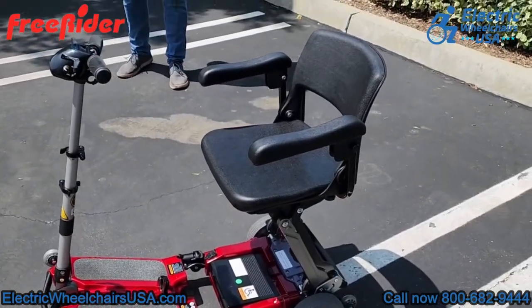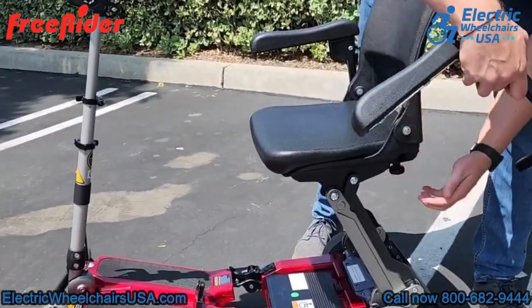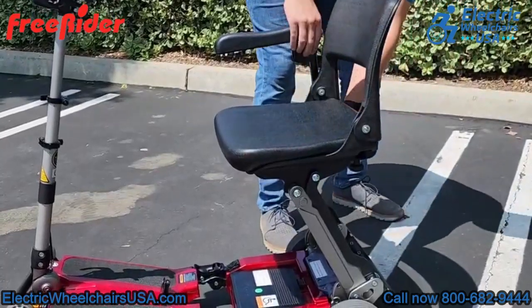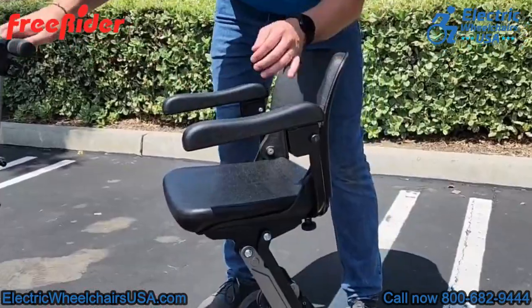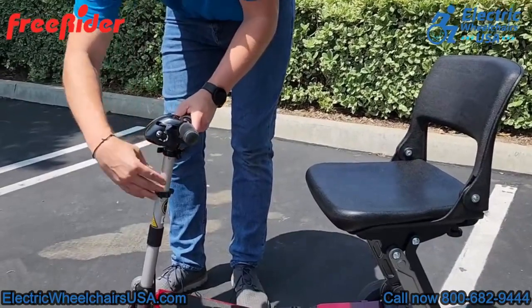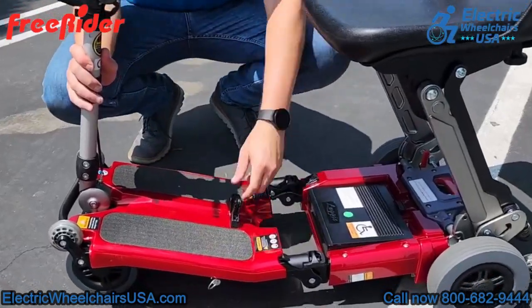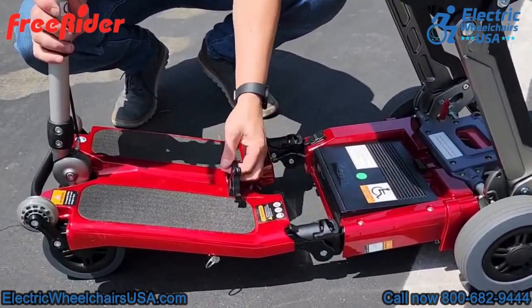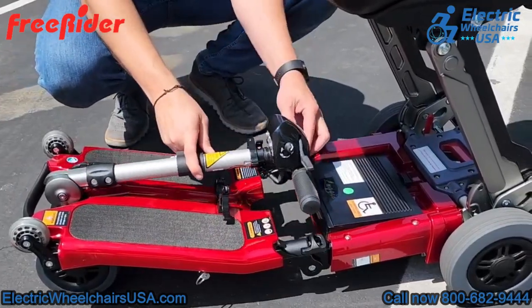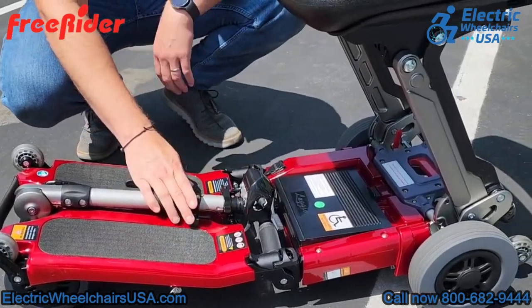One of the great things about all of the Luggies is that they're very simple to fold. With the Luggy Elite, it's important to remove the armrests first — you don't have to, you can fold it with the armrests on, but to prevent damage we advise removing them first. Make sure you turn off the scooter, then adjust the tiller height down to the lowest position and lock it into place. After that, fold the tiller down to the floorboard using the lever on the side, which also lets you adjust the tiller towards or away from you while riding.